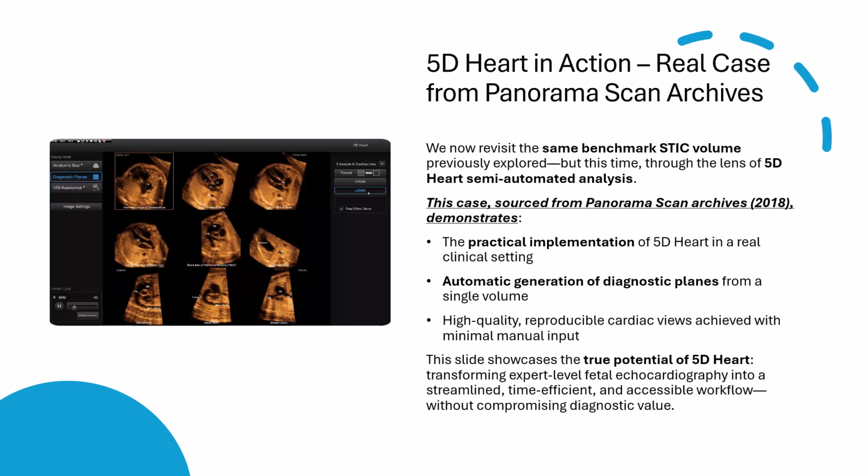It's a reminder that technology isn't here to replace expertise. It's here to amplify it, making our insights more accessible, more standardized, and more scalable across all levels of experience.